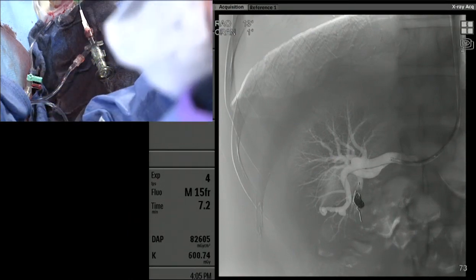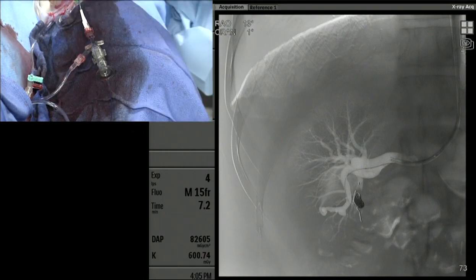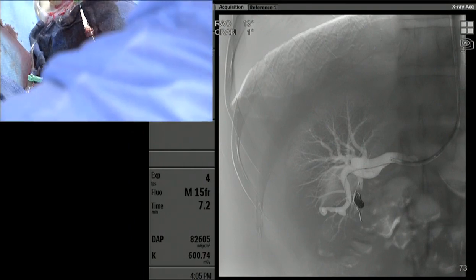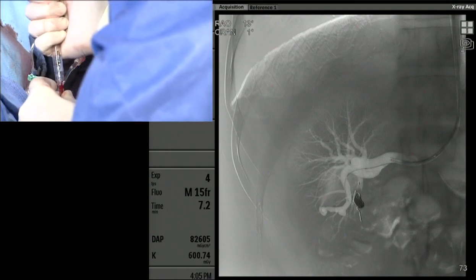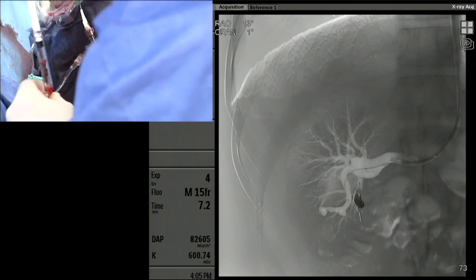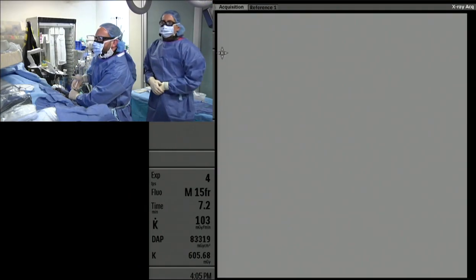Yeah, let's try the POD 4. So this is a little bit different. I think you guys saw this in the previous case. Yeah, the GDA. I think this will work well because it has different levels of stiffness. We'll put this in. We'll see if it sets up the same way, and then we'll put another MVP. And I think we'll probably be done after that.